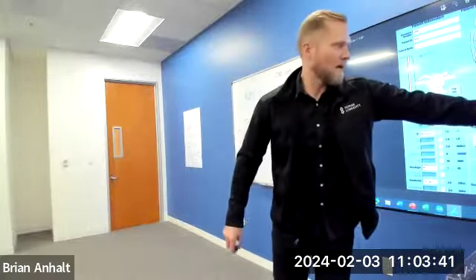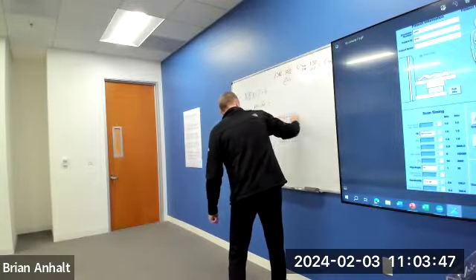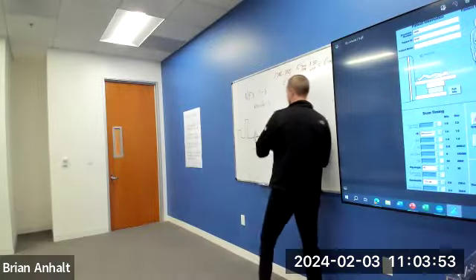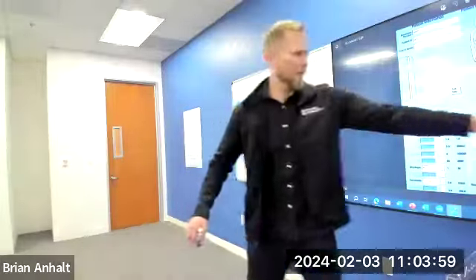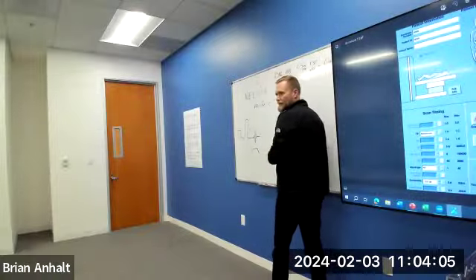We are cutting it on one side into 256 pieces. I'm not going to draw that many lines, but 256 pieces on one side. That is going to determine the size of my pizza slices in this direction. The other direction, we're only cutting it into 128 pieces, which we did here. That's going to determine the size of my slices in this direction.